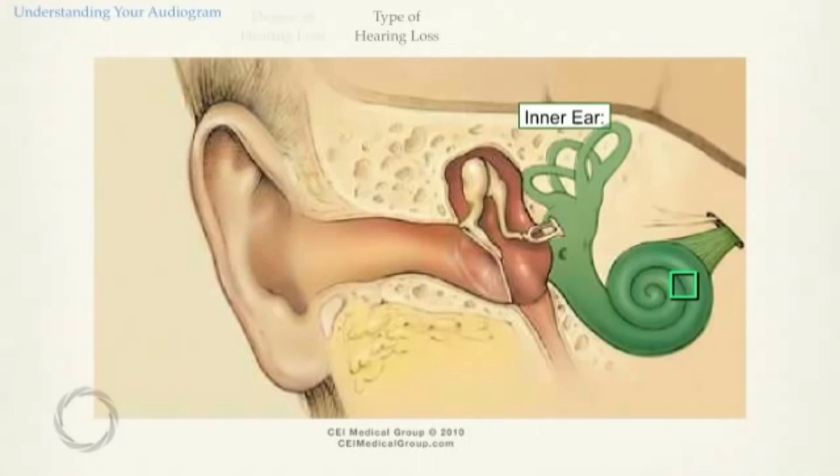Hearing loss is caused when one or more of these sections are malformed or do not function correctly.